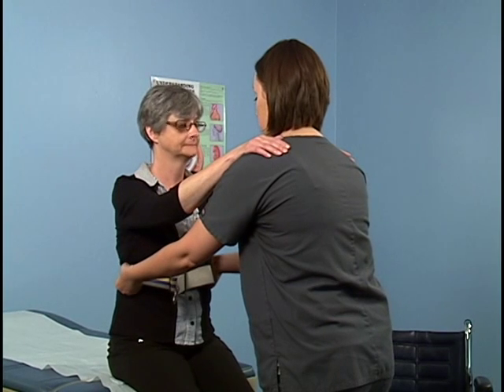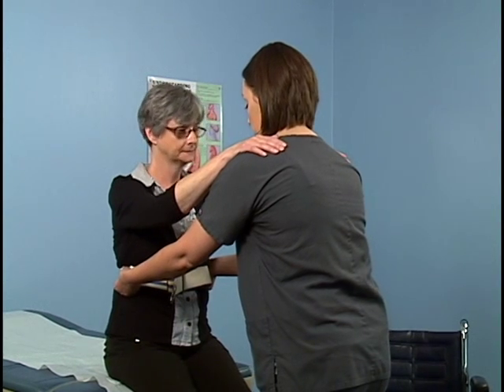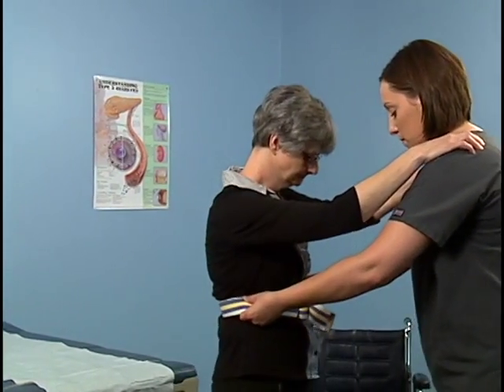Grasp the transfer belt on either side of the patient's waist using an underhand grasp and instruct the patient to stand on the count of 3, using the muscles in her legs and thighs. Straighten your knees and assist the patient to stand by pulling upwards on the transfer belt. Instruct the patient to step down from the footrest, 1 foot at a time.